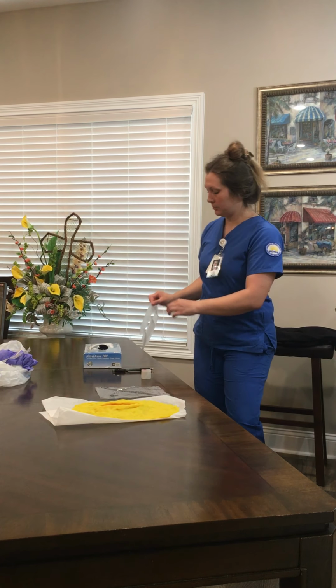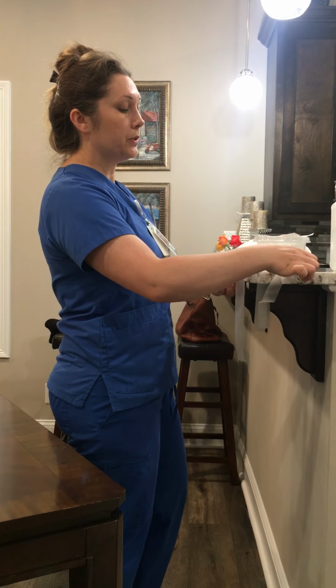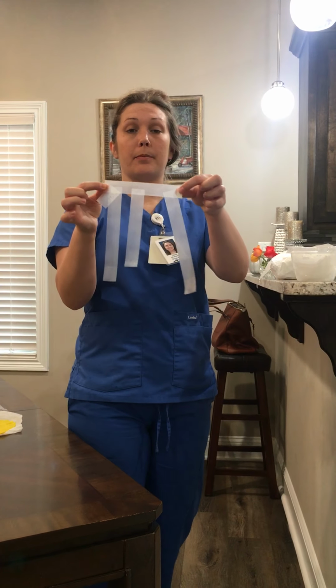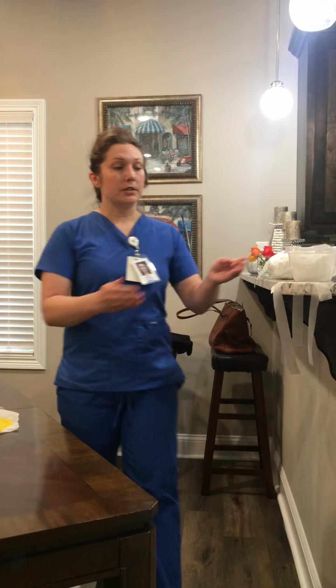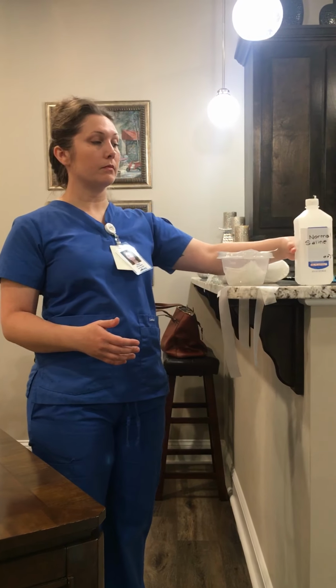I have done so, and I have my tape right here. You want to make sure that when you measure the tape, you don't want it to be too long, because that could be painful for the patient when they take it off in the future. And also, I have a little piece of tape I'm using as a barrier. That way I'm not using the tape that I'm putting on the patient directly on my side table. So I also have some 4x4 gauze, and I also have some normal saline.